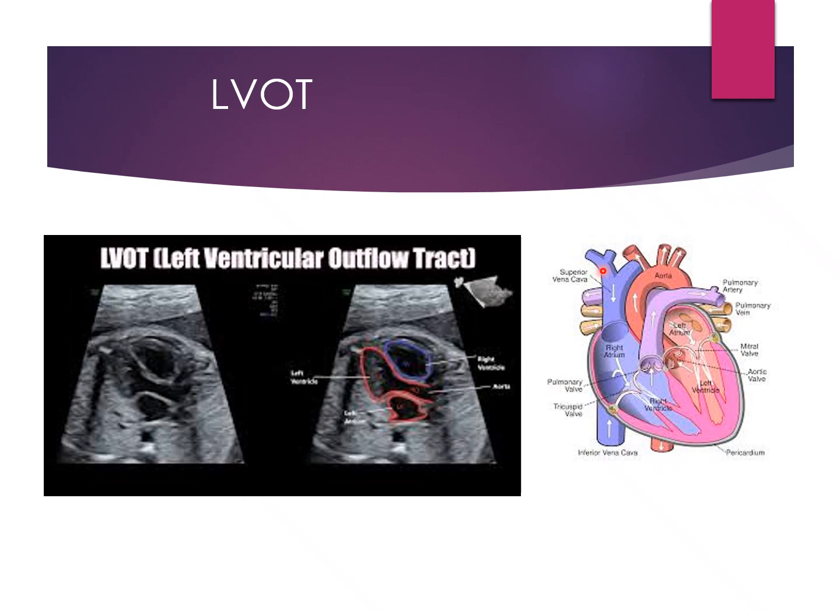If I want to see that, I am not going to cut it like this, in that kind of true transverse. Instead, let me go ahead and erase this line here. I am going to cut it to get that aorta in its long axis. See, we have it here. So if I'm cutting the left ventricle in a transverse form, I'm going to tilt my probe so that I'm cutting that aorta in a long view and have a chunk of left ventricle here. So just twisting and maneuvering your probe in order to get that view.